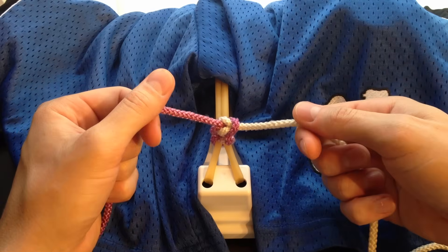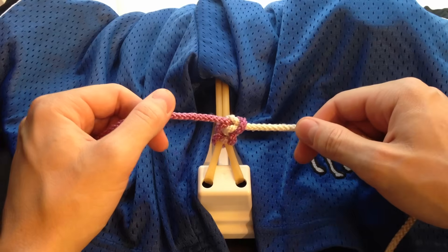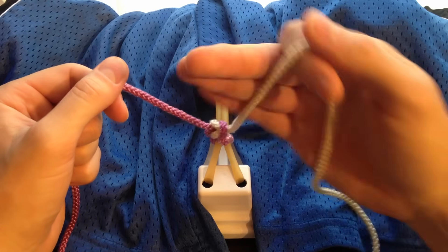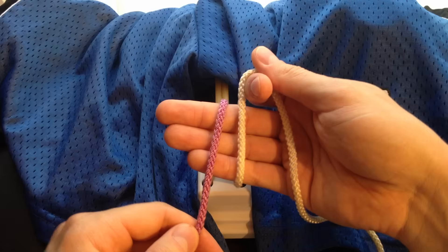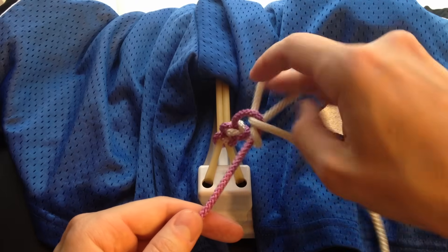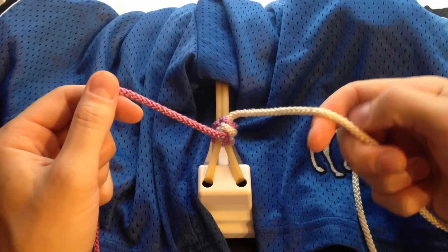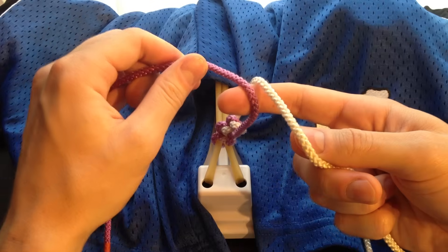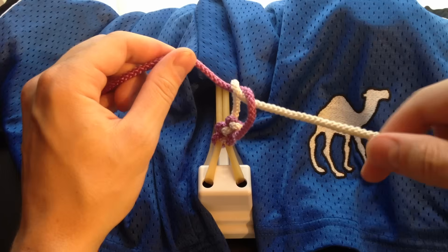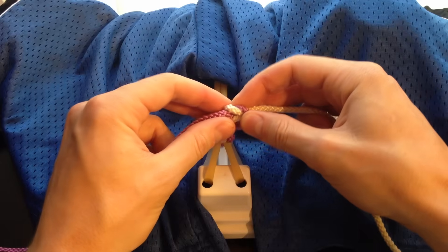Let's do one more knot. With the one-handed technique, this is a little more difficult than the two-handed, so repetition is key — just keep practicing this. So the first knot: the karate chop. Drape it over, over, under, and pull it through. To tighten it, we pull the free end away from us. With the claw — over, under, rotate it through — we pull the free end towards us. It gives us our third square knot.